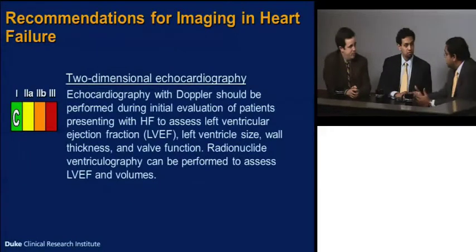So, I'm on a lot of these care patterns where we see the use of different modalities. For acute heart failure, it seems like almost every patient's going to get a chest x-ray and an echocardiogram. What are the key pieces, Adrian, that I want to know from that echocardiogram that's going to risk stratify this patient for me? Yeah, so not only the key pieces for risk stratification, but also the key pieces for identifying what therapies they should get. So just a basic function of what's their ejection fraction. That's a really important piece of information that's going to guide their care, not only during the in-hospital stay, but long term.